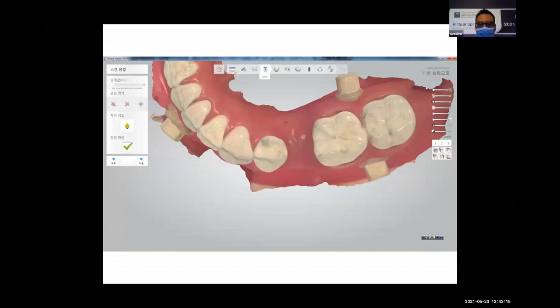And because we design all the process prior to any incision in the patient's mucosa, we can produce all the things the patient needs, such as customized abutments, temporary crowns, surgical guides, Ti-base abutments, or anything we need. In this slide, you can see an intraoral scan. Also, you can see two ceramic markers at the buccal and lingual side of the molar region and one at the buccal region of the anterior teeth.